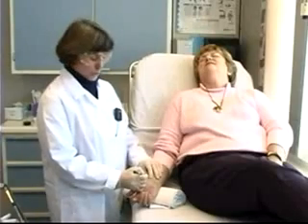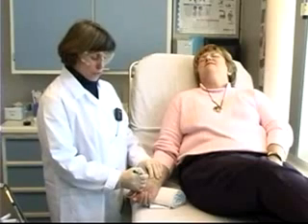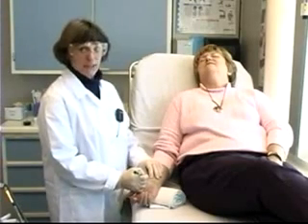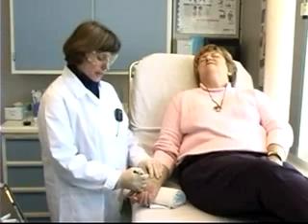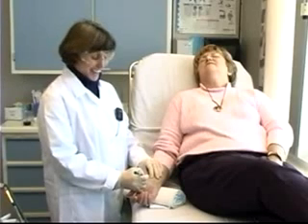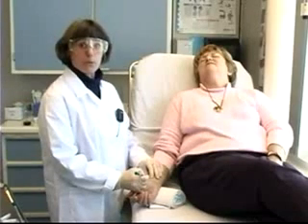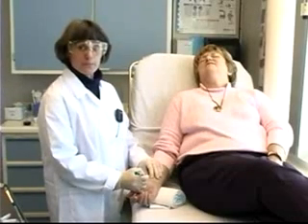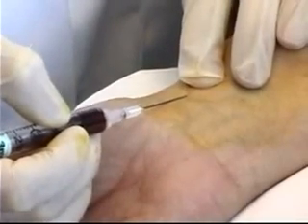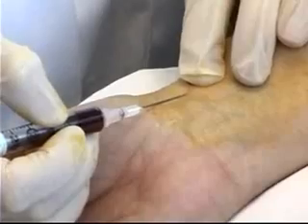Once the needle is through the skin, watch for a flash of blood into the hub of the needle, which indicates you've accessed the artery. You can then watch for blood to pulsate back into the syringe. An adequate sample is one and a half to two cc's of blood.